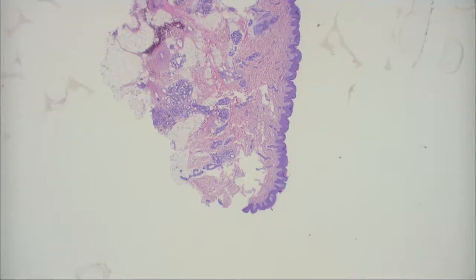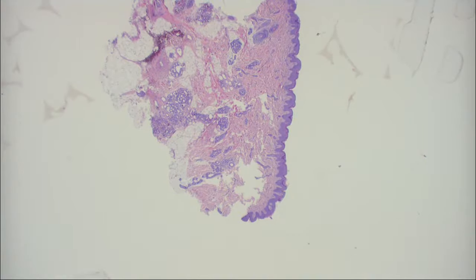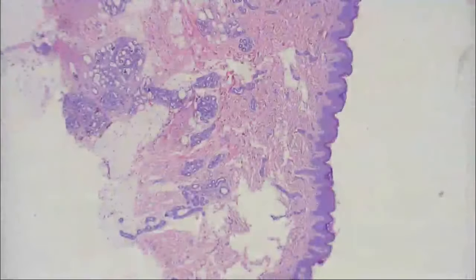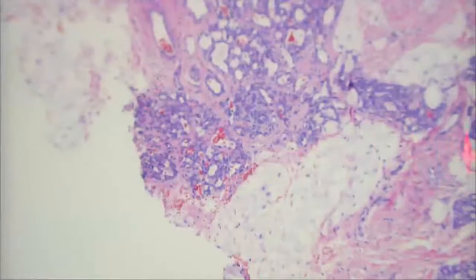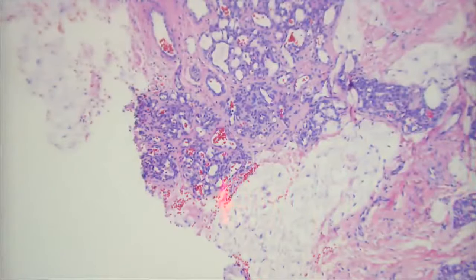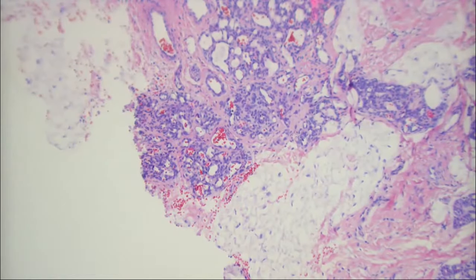So what did you think we saw in this youngster? These structures in the dermis that have these spaces, they look like basophilic cells, kind of glandular. Okay, well, let's go to higher magnification. These up here are glands for sure, and those spaces look more like blood vessels. Good. Excellent. And notice how they're arranged in all these little tufts. They're kind of little glomeruloid aggregations.